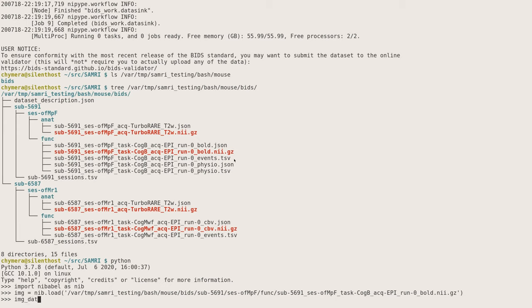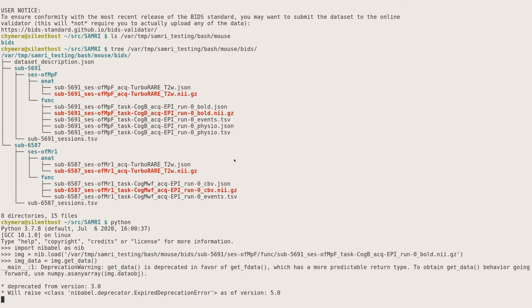If you want to look at the data, just extract it via the getData method. And you're already done in the sense that you already have a Python NumPy array. So starting from now, you can do all sorts of matrix manipulations, whatever you want. This is, of course, not the only thing which you can do with BIDS metadata.